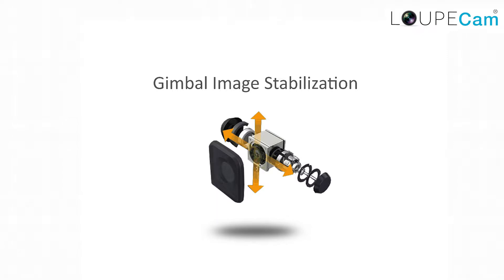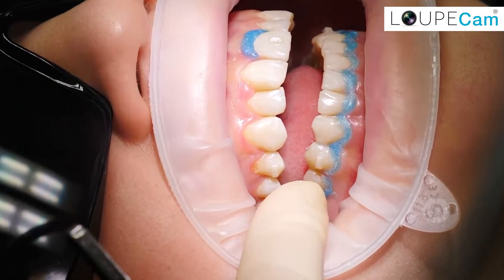Bob here from LoupeCam, and I'm here to show you how to leverage the full potential of our new LoupeCam 4K iQHD camera. Unlike other products on the market, the new LoupeCam 4K camera comes with gimbal image stabilization plus amazing autofocus.